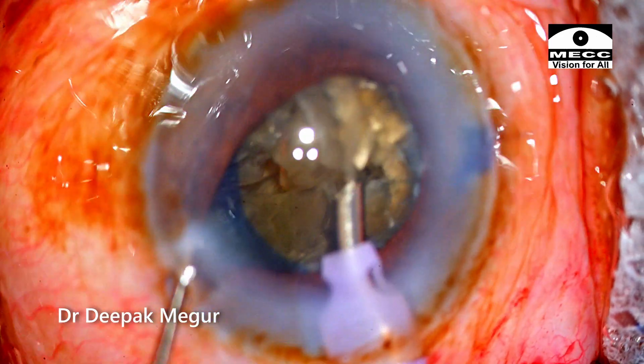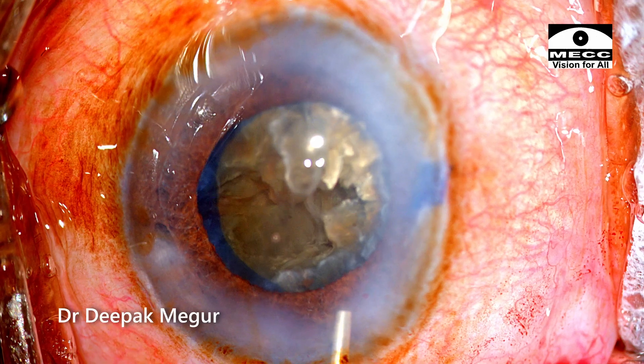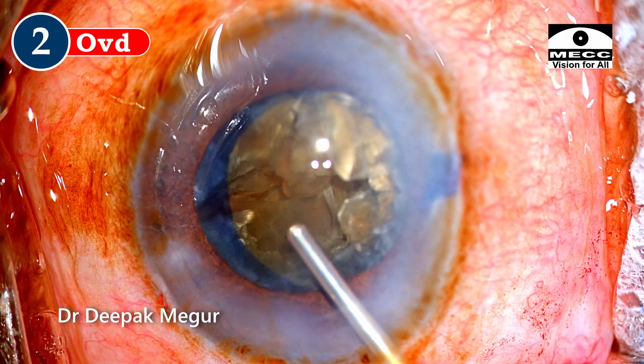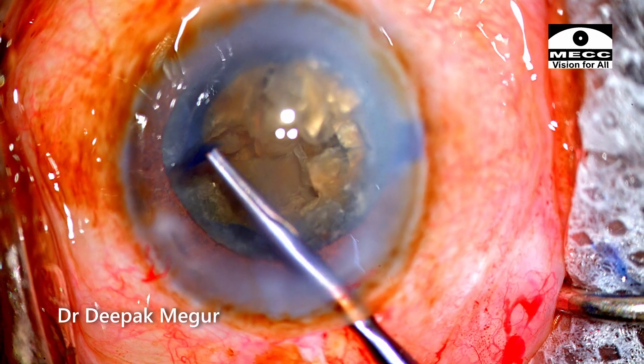At this moment the pupil has come down, so I am injecting some intracameral mydriatic — adrenaline or phenylephrine — just to maintain proper mydriasis. I also realize that a bigger rhexis would be beneficial, so I go ahead and enlarge the rhexis.